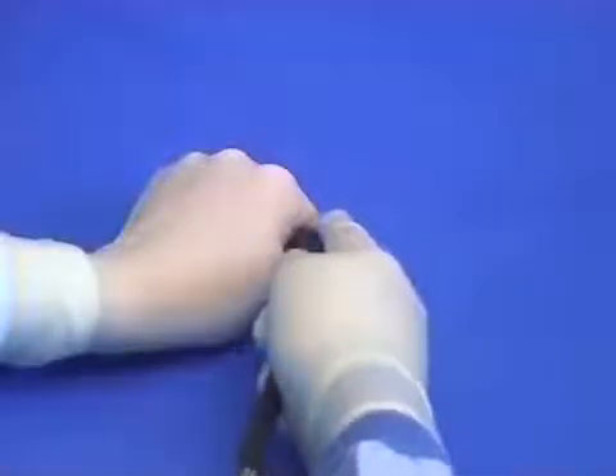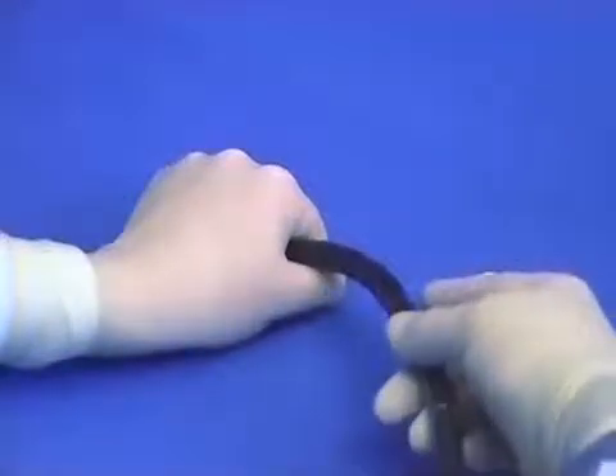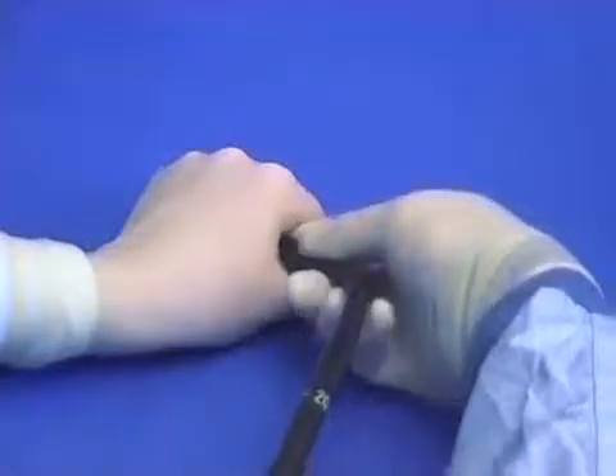There are several ways of inserting the scope into the anus. Either supporting with the fingertip and gently inserting, or alternatively doing a digital examination and then, as the finger withdraws, pushing the endoscope in alongside it.